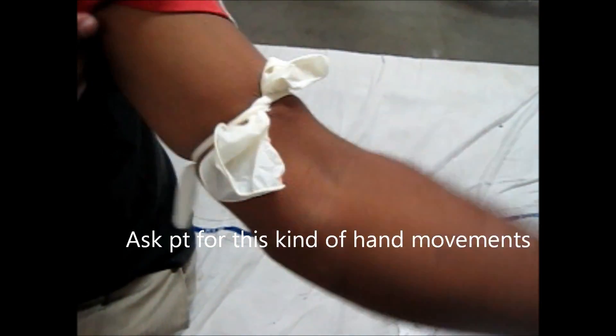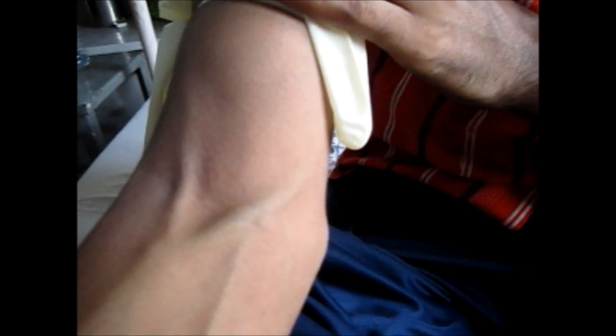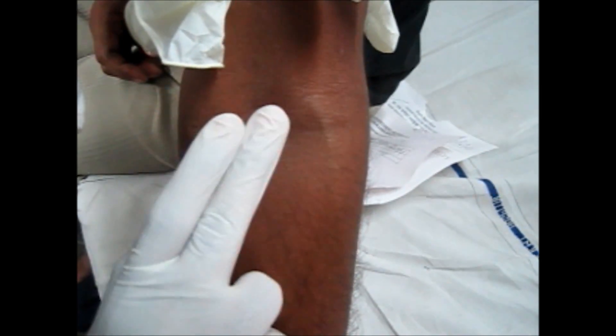In order to take the blood sample from your arm or the cubital vein, tie a tourniquet like this. Ask the patient to perform this exercise so that you can have dilated veins. Either you will have dilated veins or you need to palpate the veins.